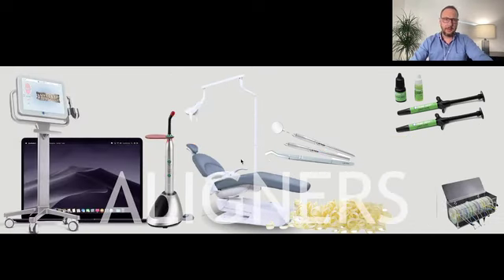I always have my computer with me, because this is where I do the plans and check the clinic. For our appointment, I have the treatment planning open when I see the patient, to compare and show. They like to see the evolution, to compare on the screen if they are on track or not.